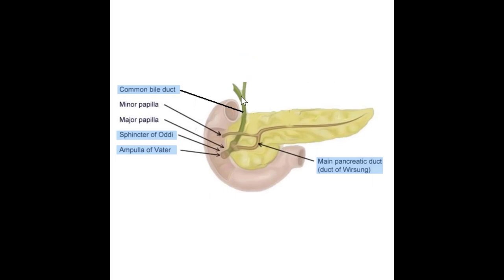In this image, we can see the common bile duct coming down in the pancreatic head, joining up with the duct of Wirsung. They enter through the ampulla of Vater right into the duodenum. The sphincter of Oddi is a muscle that wraps around the bile duct at the ampulla, contracting and relaxing to allow substances to flow in or stopping them when the body doesn't need them at that moment.